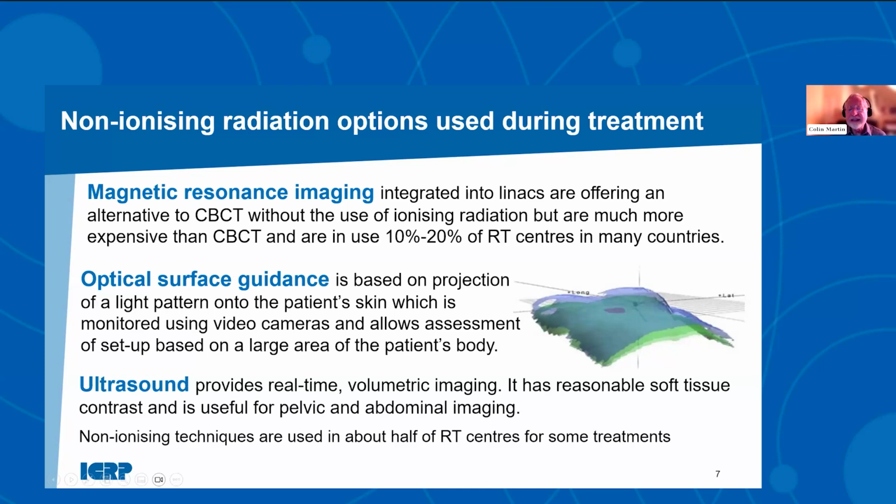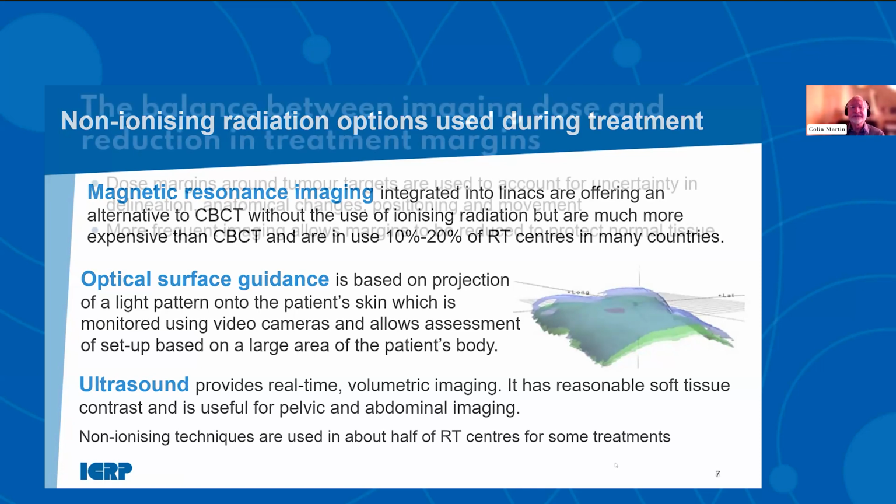Ultrasound provides real-time volumetric imaging, and it's got quite good soft tissue contrast, so it's used sometimes for pelvic and abdominal imaging. And non-ionizing techniques are used in about half of the radiotherapy centers for some treatments.